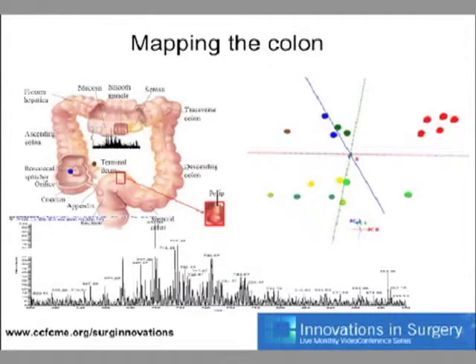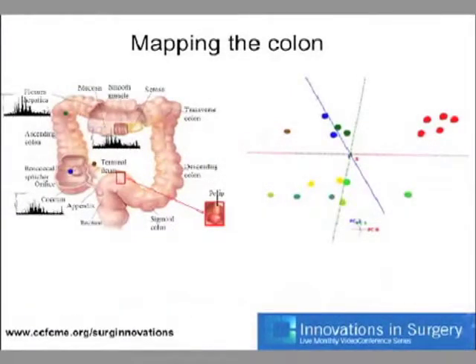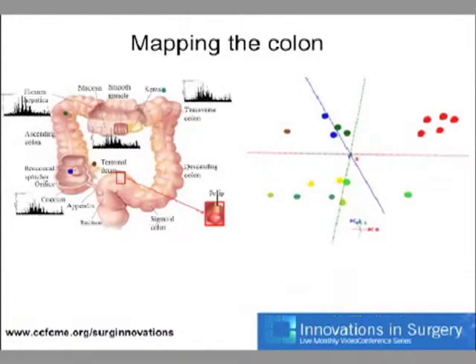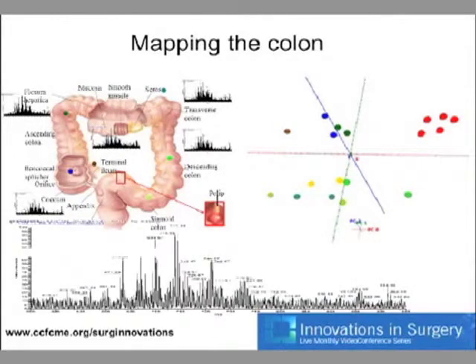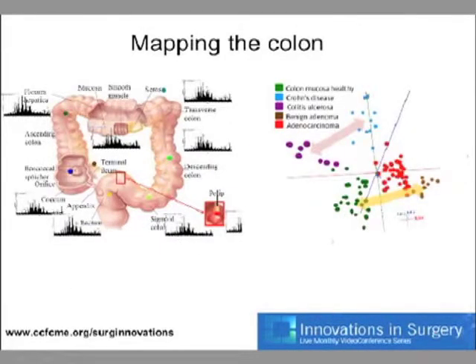Now, when they trialed this initially in Hungary and in Germany, they were able to differentiate between not just different types of cancer, but inflammatory disease and malignant disease of the bowel with a reasonable degree of accuracy. If you just go on one more slide, please. Apologies for the number of animations. Yeah, so you'll see that data there. So you can distinguish inflammation from cancer, again, because obviously it has a different expression of lipids. Next slide, please.